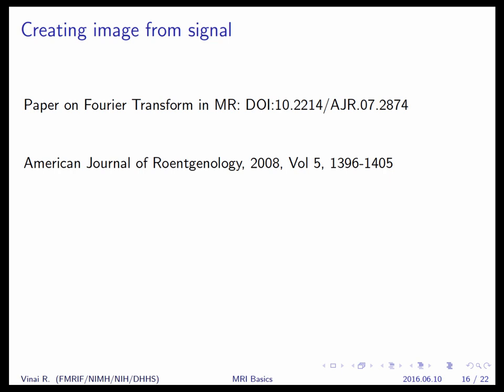The Huettel and Song functional MR book actually has one picture that has a really nice depiction of this, where they show K-space and different points along K-space and the variations that these points account for. This gets back to Fourier theory, where if you add up all these variations, if you have enough of these regular functions, you can recreate almost any arbitrary 1D or 2D or even 3D waveform or object.